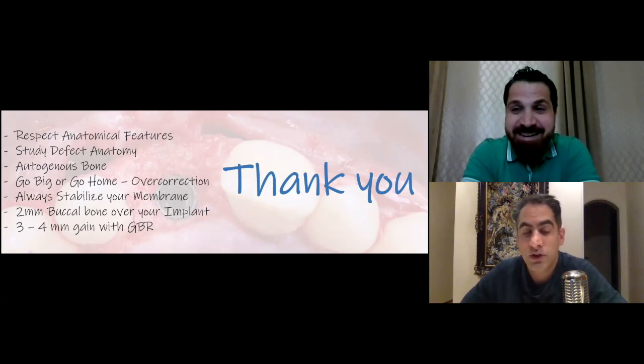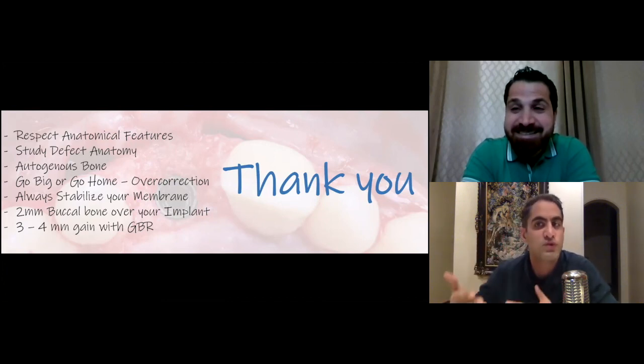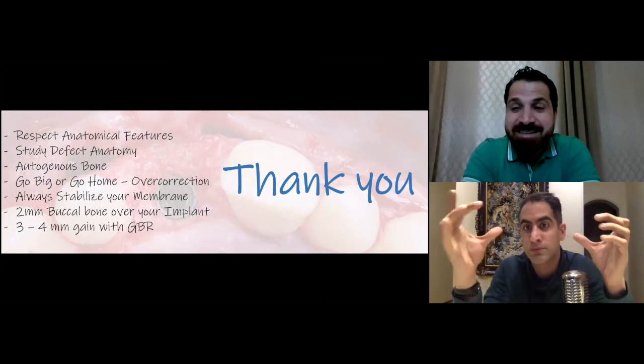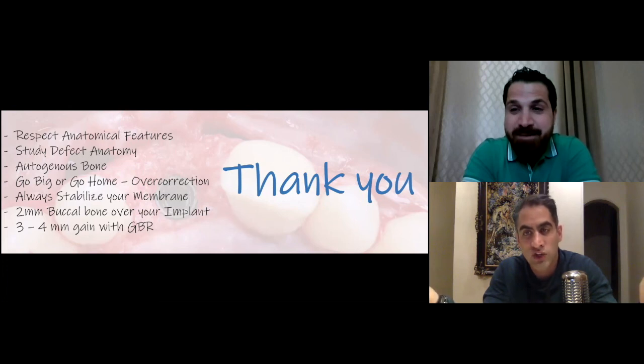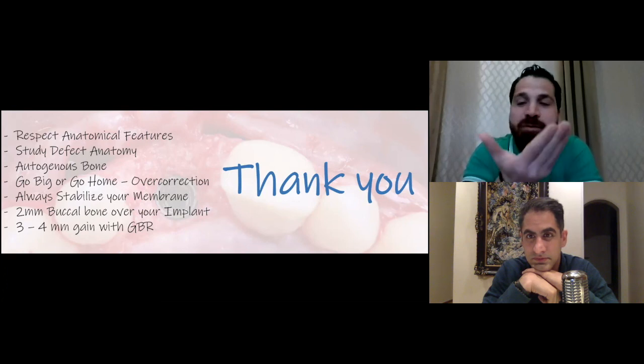I'm interested in the results, because when you build up the bone, you're reducing even more space for the future crown and the occlusal contact. And when the implant is placed toward the palate, I want to know what the next plan was for restoring the case. I know that we don't have time for that, but did you have space for the crown regarding that deep bite your patient had? Yeah, actually he has a deep bite, but the emergence of the implant is really away from the lower incisors.